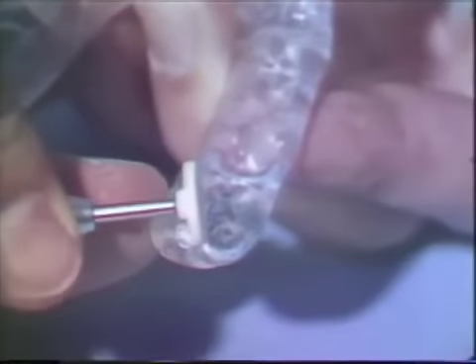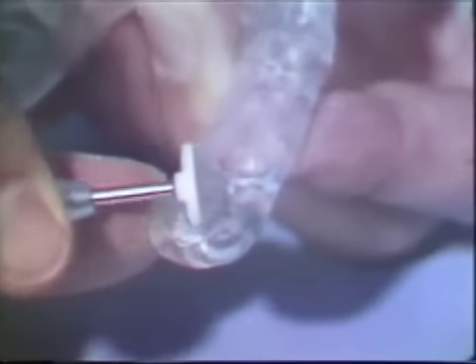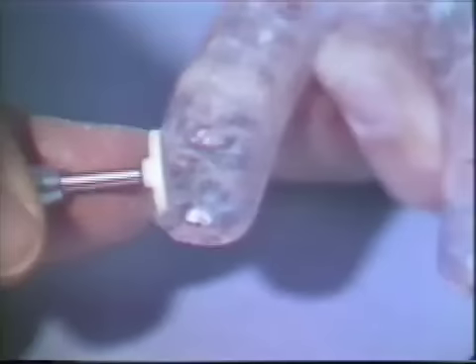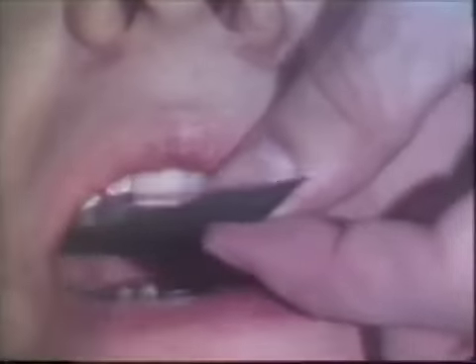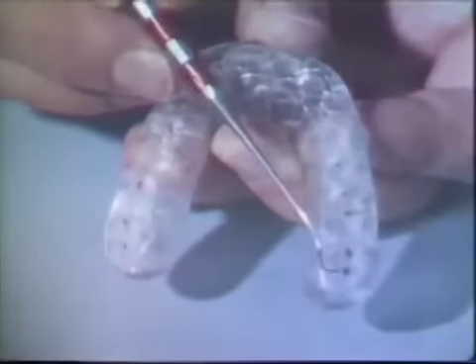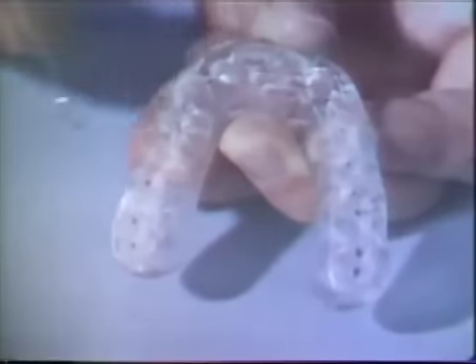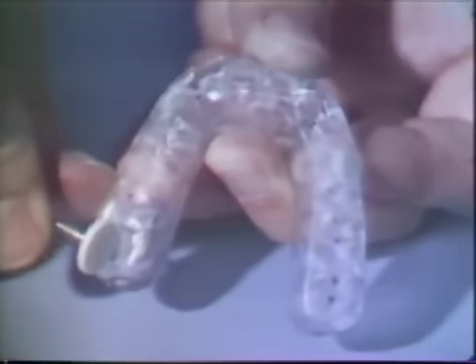The heavy contact markings are removed with a wheel type stone. The stone should be fairly large in order to maintain a flat surface, and only a thin layer of acrylic is removed. Centric relation contacts are remarked. An increased number of teeth are now contacting the bite plane.